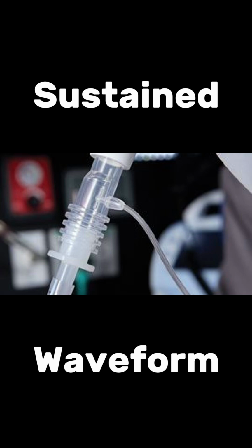We see them every breath. An ET tube that is placed in the esophagus, well, it might produce a few small waveforms initially, but then they quickly disappear. Sustained waveform means you're in the trachea. If you don't have sustained waveform, you should immediately be concerned.